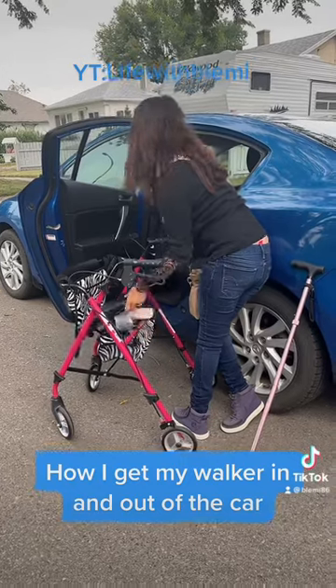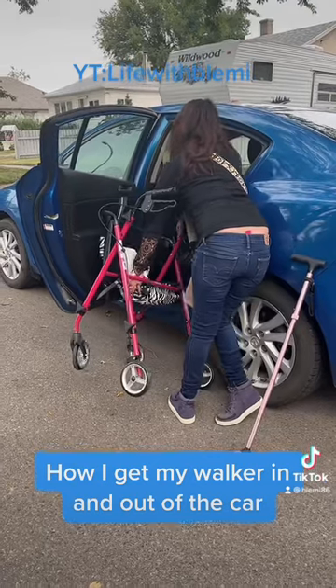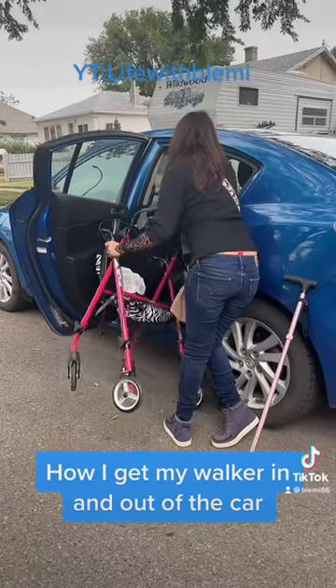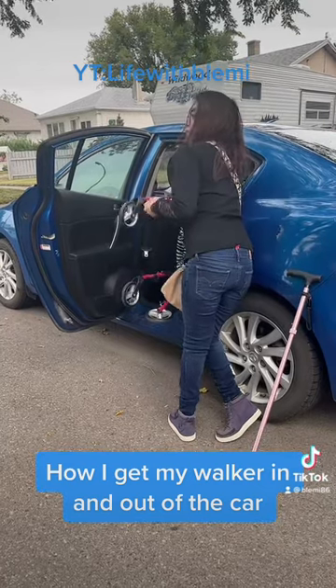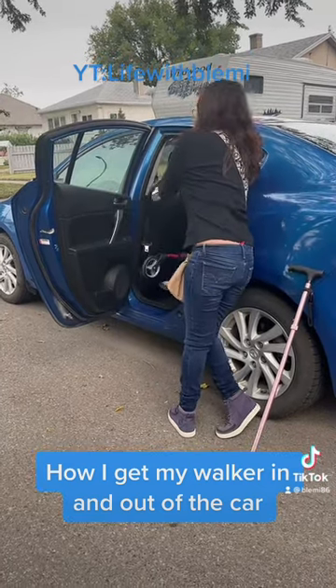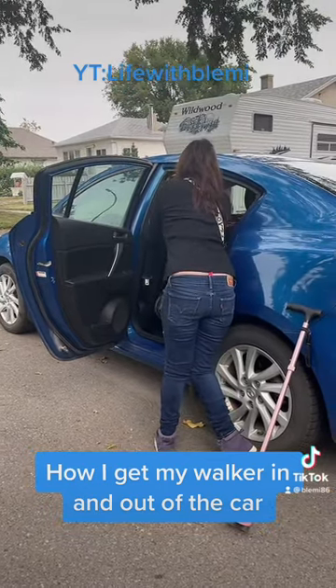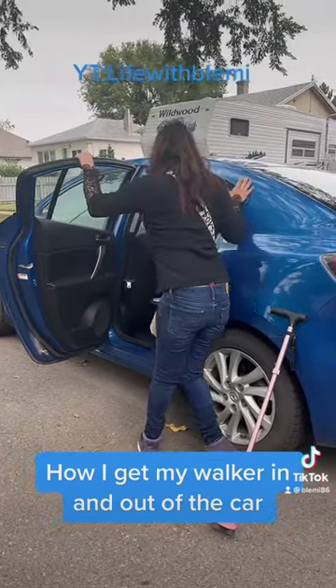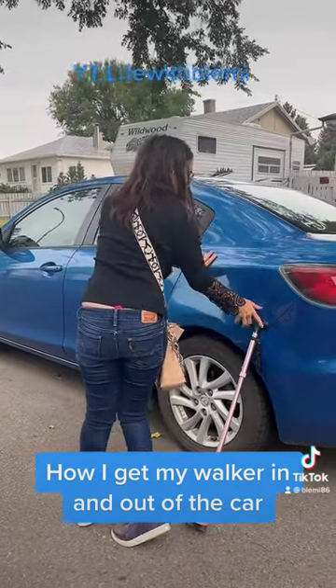Putting it back in is basically the same. I use the car as a leaning post, and I just hoist the walker back up into the back seat of the car. And then I push it in. And then I'm ready to go back to the driveway. There you are — we'll be right back.